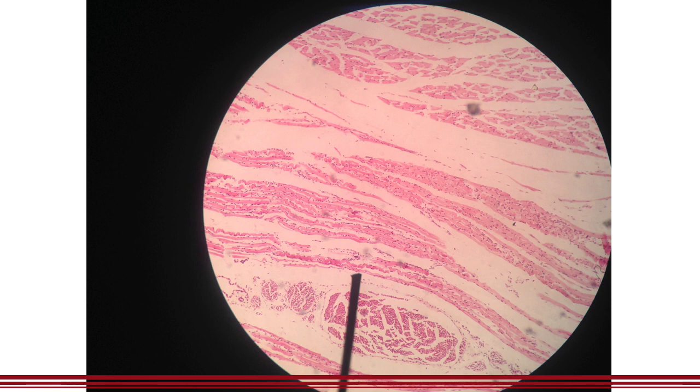You might notice that the bundles of cells here are quite different when compared to this one, because you're looking at the side view here, while in this one you are looking at the cross-sectional view. This is the inner circular layer and the outer longitudinal layer. If I'm not mistaken, this should be located in the esophagus.